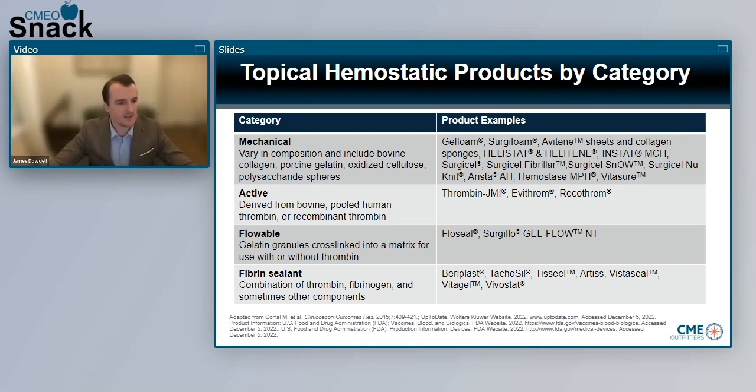No, I think it's a great point. You can see, right, the choices can be overwhelming for the amount of products there are. So you want to know what the surgeon wants to use and what they're comfortable with, because that enables successful surgery. So I think that's a great point. Communication between the teams is fantastic.